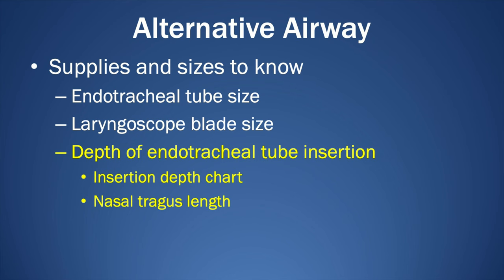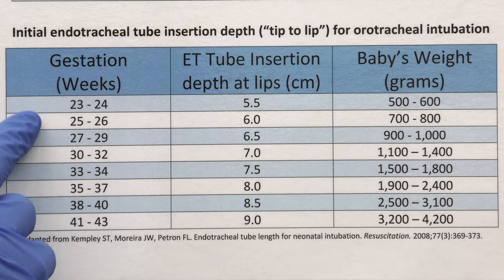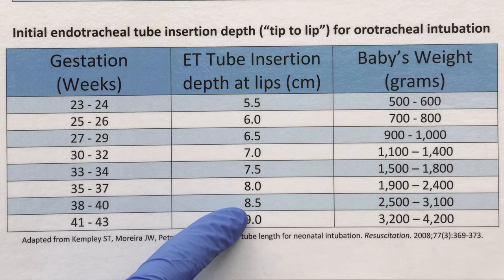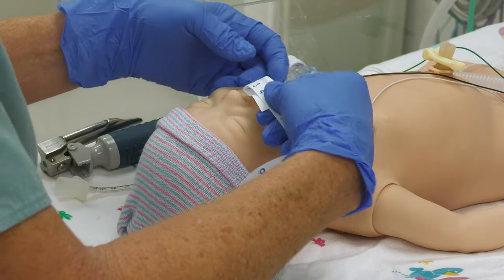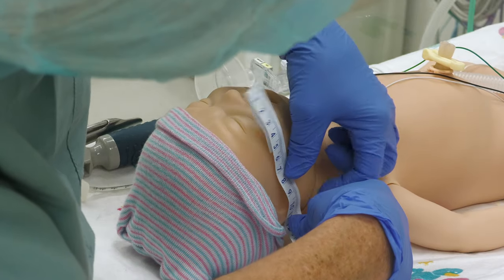The depth of endotracheal tube insertion is the distance from the tip of the tube to the baby's upper lip. There are two methods to estimate this depth. The NRP program provides an initial insertion depth chart. Simply find the gestational age of the baby you're intubating, and the depth in centimeters is given. Insertion depth is also estimated by the length between the nasal septum and the tragus of the outer ear, plus 1.